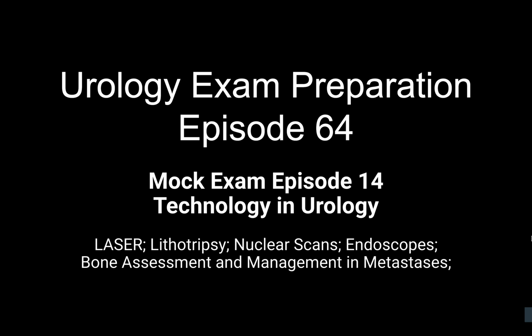It works by the fact that DMSA is completely absorbed by the renal tubules. It is neither filtered nor secreted by the tubules. And so a static image is taken about 2 to 3 hours after injection of the contrast, and this shows areas of scarring.